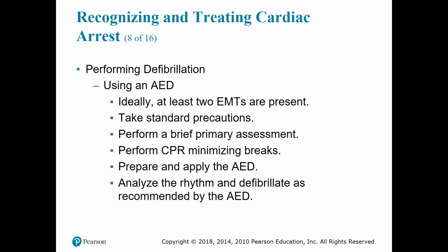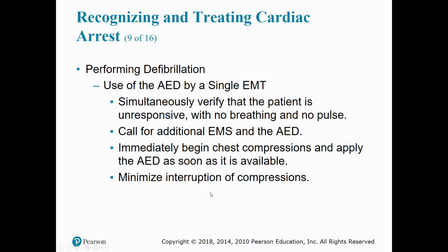Anterior posterior placement: one pad is placed on the left anterior chest just below the left nipple, and the other pad is placed on the left posterior thorax just below the lower margin. They most of the time have pictures that show you exactly where you need to put those pads. So alright, next is to analyze the rhythm and defibrillate as recommended by the AED.